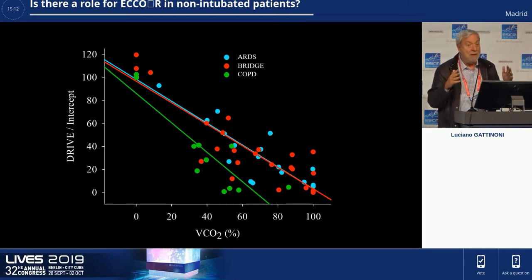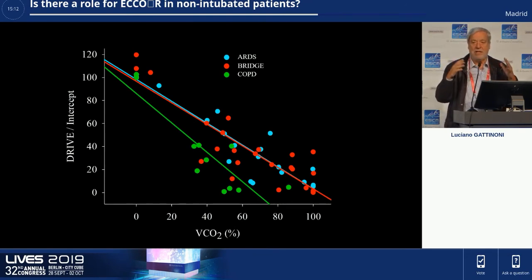But to me, one of the problems many of these patients have is that they start hyperinflated. And they know they need to be ventilated. But to ventilate a patient who is already with a lung like this is a little bit complicated, and I was never really convinced that there couldn't be a better system. With extracorporeal CO2 removal, everything becomes far smoother. You decrease the PCO2 and they readapt and they deflate slowly.